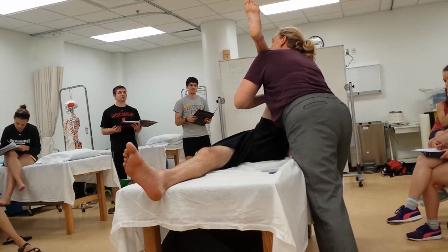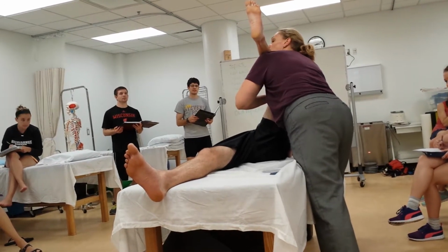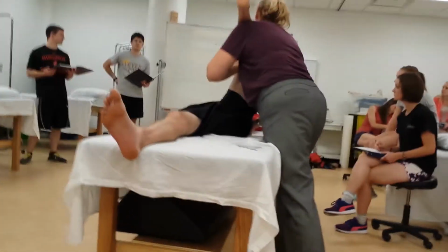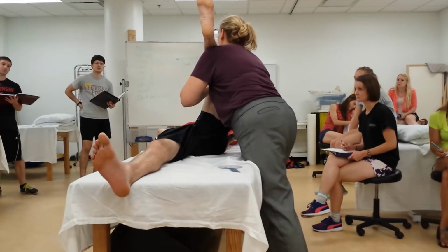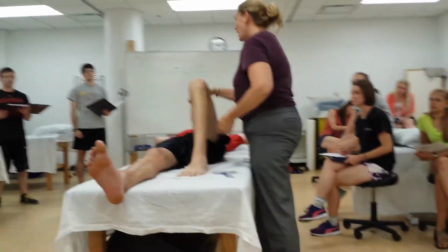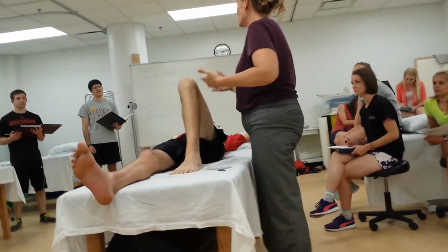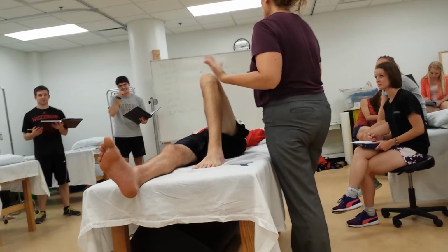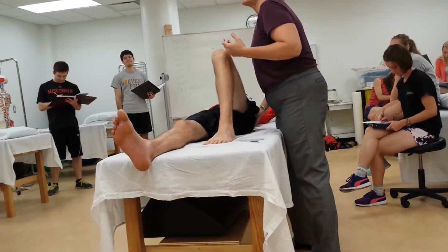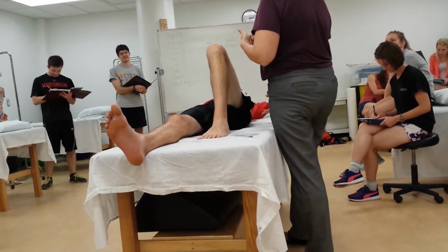Okay, and now his pelvis is starting to come up. Okay? So where on the pelvis are you holding it? So I actually have my finger on his PSIS. Okay. What Berryman Reese says is that you should have your hand over here. I don't know how you physically do that with only two hands. So that is how I would do it. Okay, so PSIS. Okay? On the same side. Yeah, because all I care about is I don't want that pelvis to rotate.